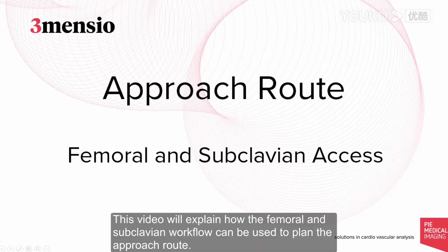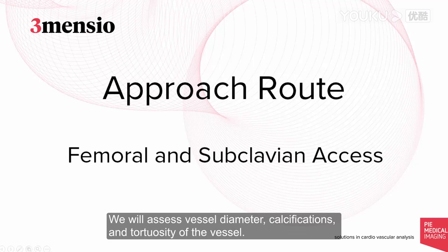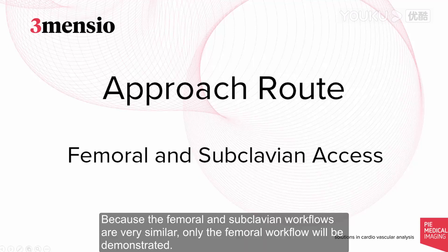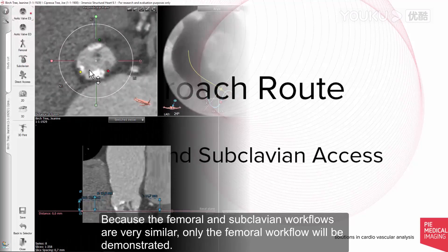This video will explain how the femoral and subclavian workflow can be used to plan the approach route. We will assess vessel diameter, calcifications, and tortuosity of the vessel. Because the femoral and subclavian workflows are very similar, only the femoral workflow will be demonstrated.